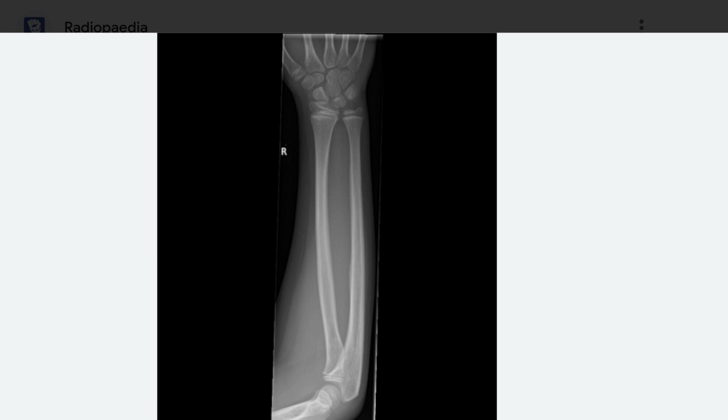Plain radiographs are the most commonly ordered initial investigation by an orthopedic surgeon to understand the pathology, make diagnosis, or confirm clinical finding. The X-ray should be read in a systematic, meticulous manner in order not to miss findings and pick up even subtle change that will reveal some uncommon disorder.